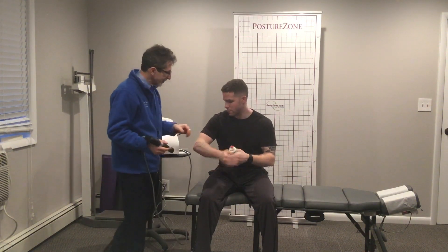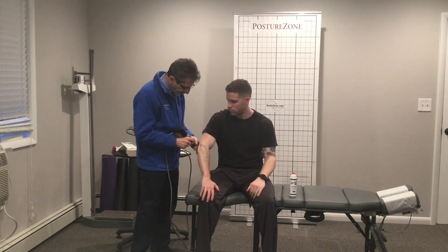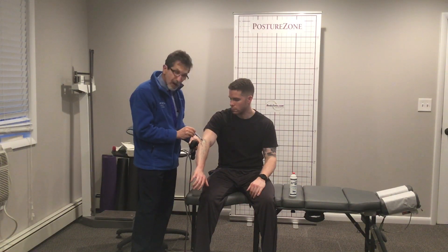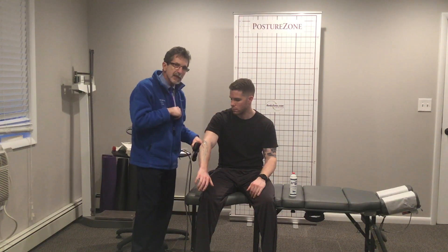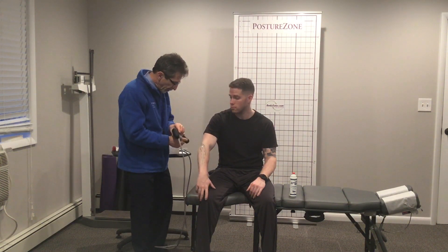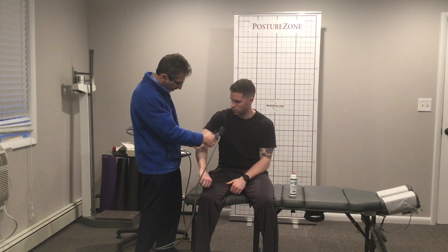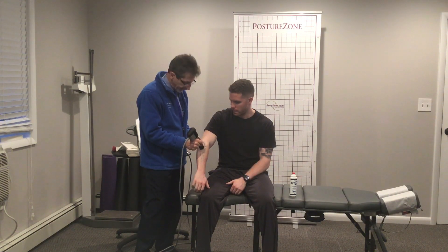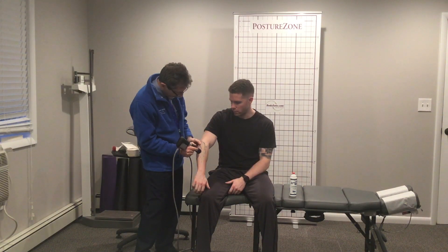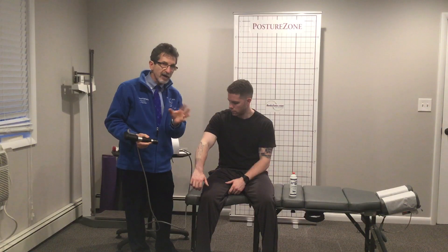It was really sore on the lateral epicondyle where that common tendon comes in, so I'm not going to put the therapy that close. I'm going to put the therapy around it, and I may even come circumferentially from other areas. Remember, it's like dropping a pebble in a pond — creating waves that circulate out. By circulating out, you can get an effect on the target tissue, which is where that common extensor tendon attaches. Another hot spot here, so we drop down. We don't want it too painful — you want to work around it. If I put my finger here, I can feel those pulses going all the way up to that lateral epicondyle. We would work the whole area from different directions, keeping that pain in the 5–6 range.